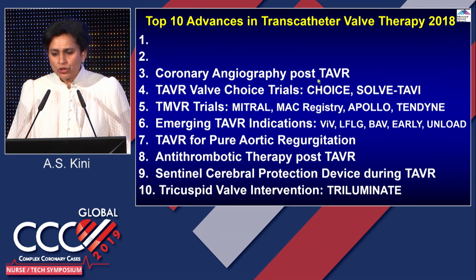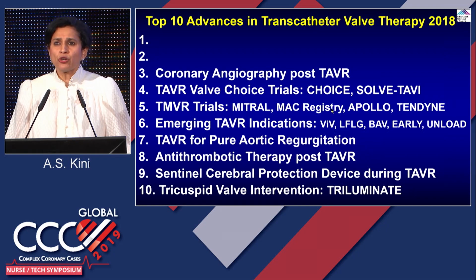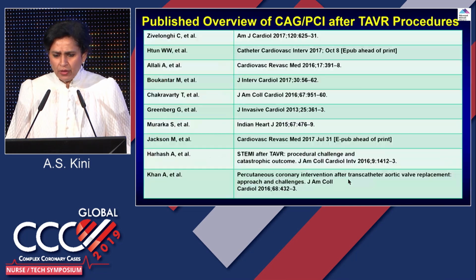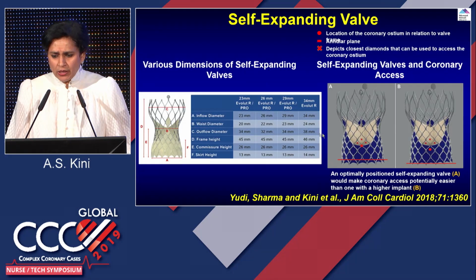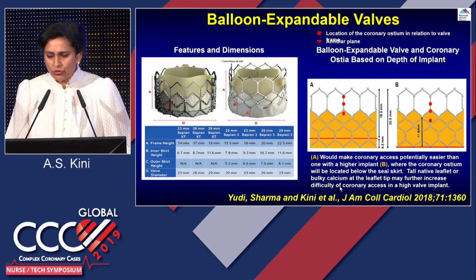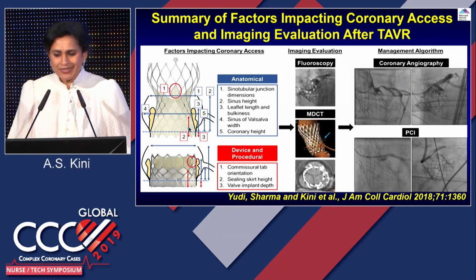Now, coronary angiography post-TAVR. We were the first to publish about this, post-TAVR angiography, that came out last year in the Journal of the American College of Cardiology, which discussed everything about the valve. So like I mentioned, when you're positioning the valve, there are a couple of things. One, where you positioned it. These are the various valves. You have the skirt, the leaflet, the length of the valve. So a lot of things were taken into account.